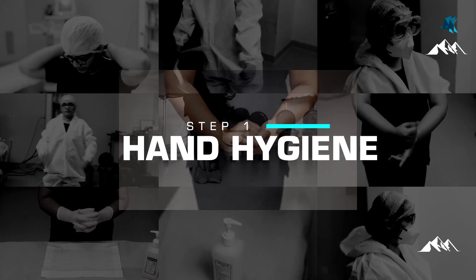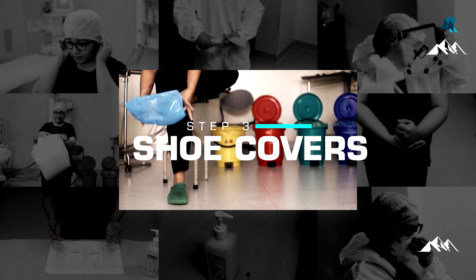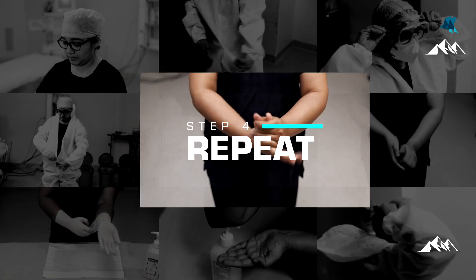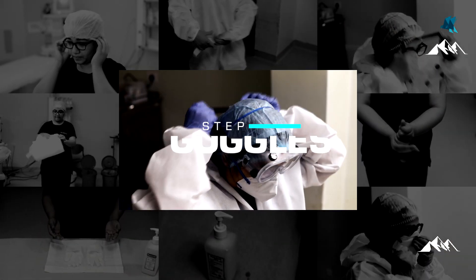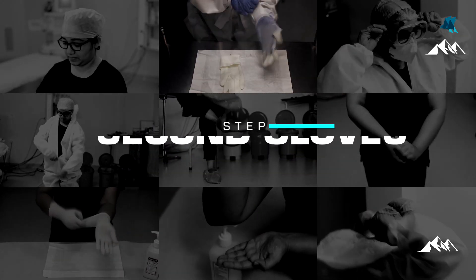Step 1: performing hand hygiene. Step 2: putting on head caps. Step 3: putting on shoe covers. Step 4: repeat hand hygiene. Step 5: wearing the first pair of gloves. Step 6: wearing the gown. Step 7: wearing the respiratory mask. Step 8: putting on the goggles. And finally Step 9: the second pair of gloves.